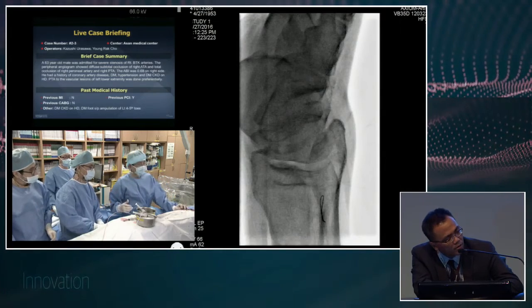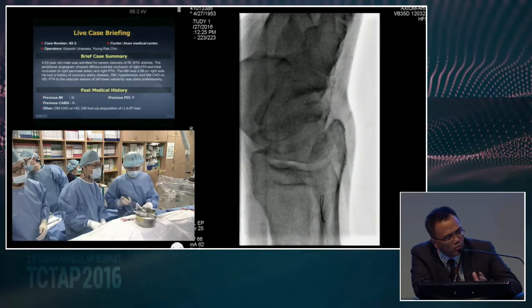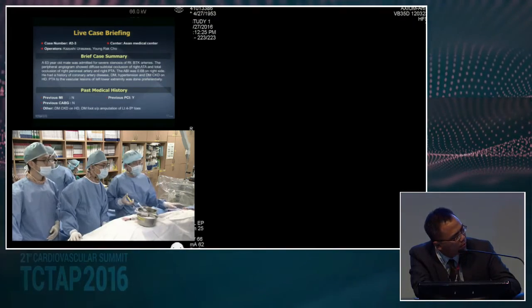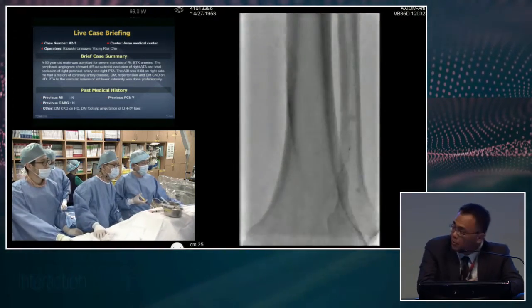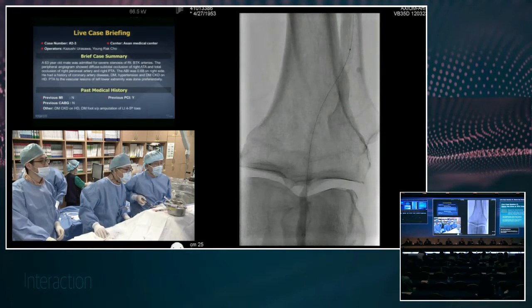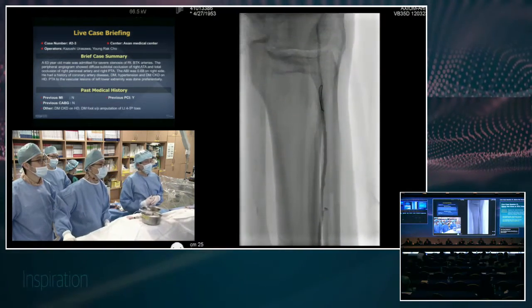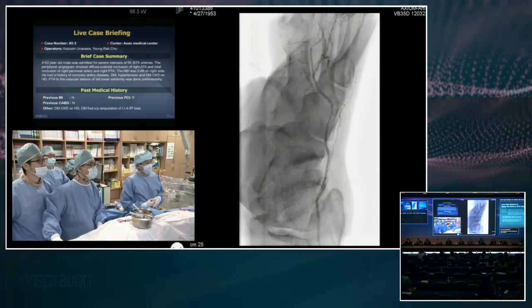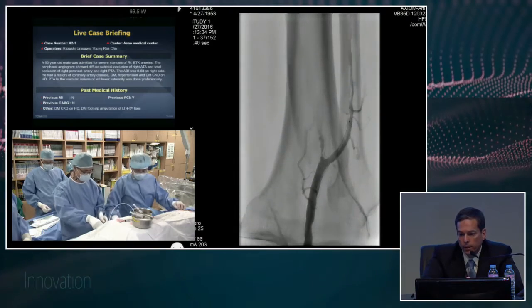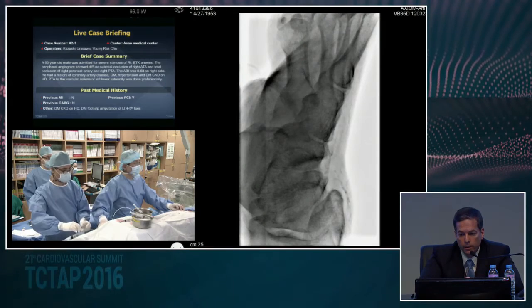Anybody has any opinion on whether there's actually evidence and the need for a tapered balloon, or go straight for 2.5 or 3 by 200, proximal to the distal? I don't know that there's any data to support it, but the challenge I have with tapered balloons or long balloons is it's usually a better final balloon. I like dilating up the principal arteries, focal areas, to crack it. Then I think those compliant or semi-compliant balloons tend to dilate nicely and give you a lot of usefulness. I like the tapered balloons. I think they're actually quite good.